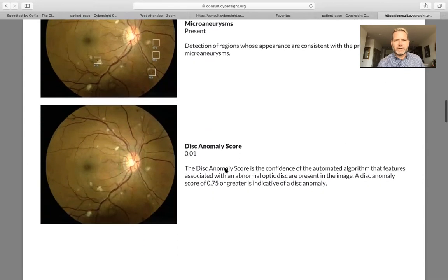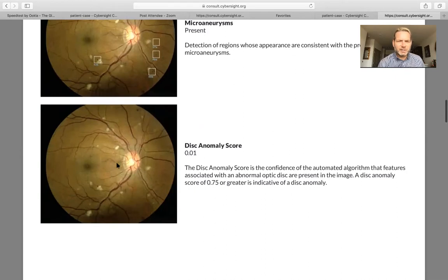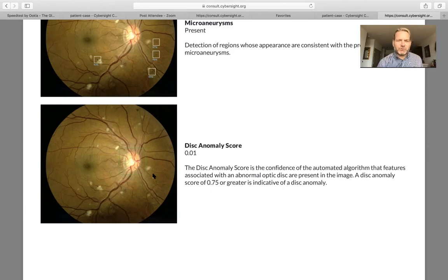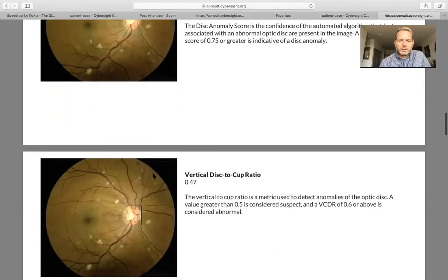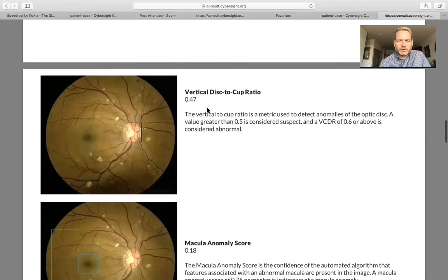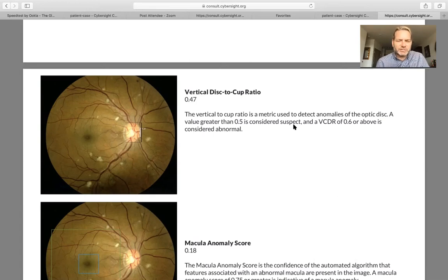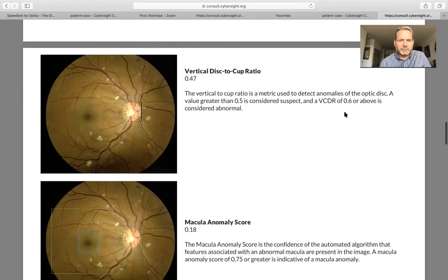The software also analyzes the optic disc on every patient. While this one may be a 0.4 or 0.5, it is passing the grading system, as this particular set of photographs did not have any evidence of glaucoma changes. We do get a vertical cup-to-disc ratio on this diabetic patient — here it's being estimated at 0.47, just under the threshold of 0.5 with which we consider glaucoma suspects, or 0.6 where it is a definite abnormality.